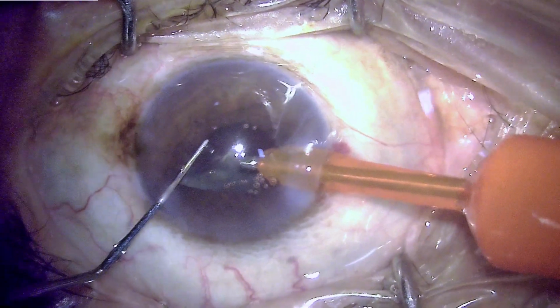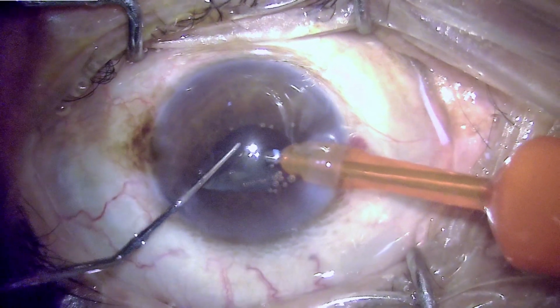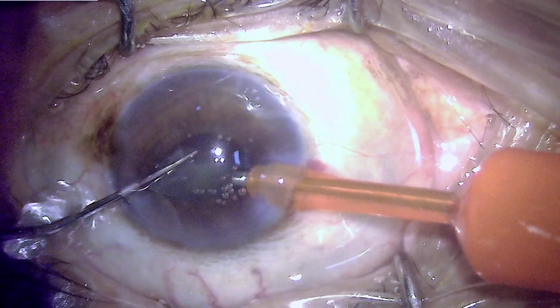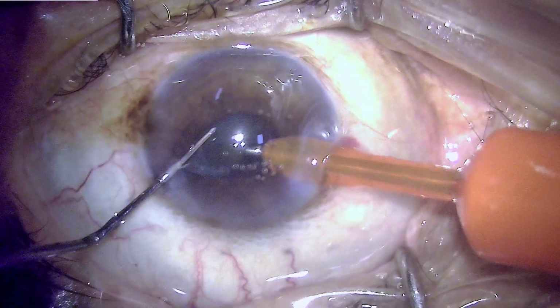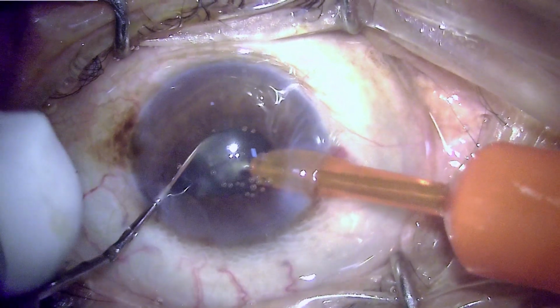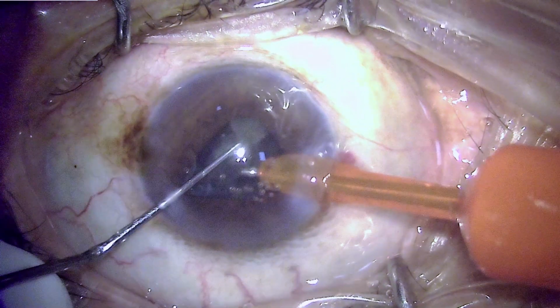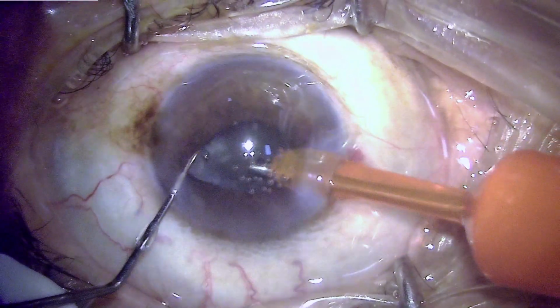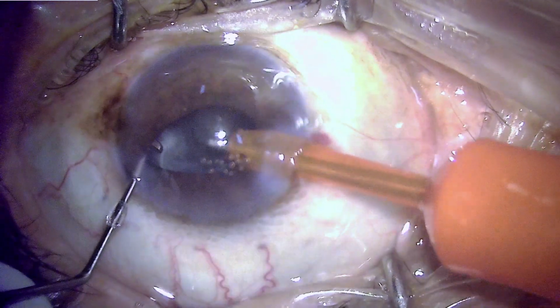One very important clue here is that once the piece has been emulsified, at that moment one should always consider that the iris would be ready to come into the aspiration port, so one should keep that tip away from the other end, the diagonally opposite surface of the iris.